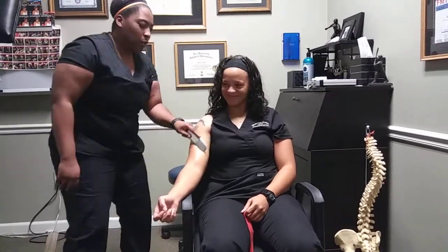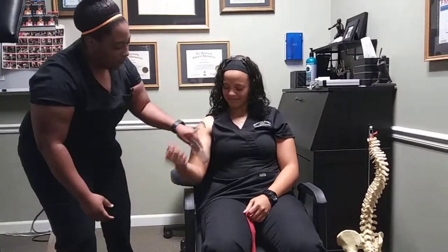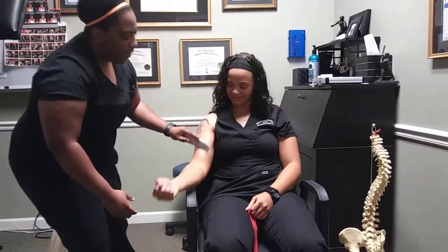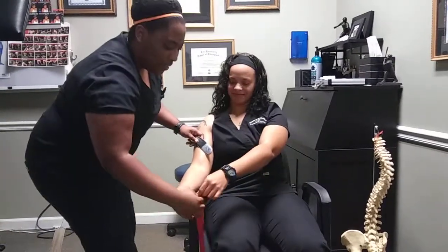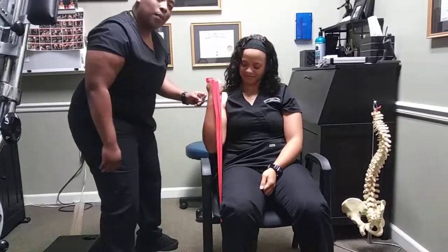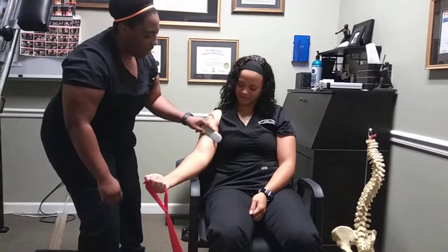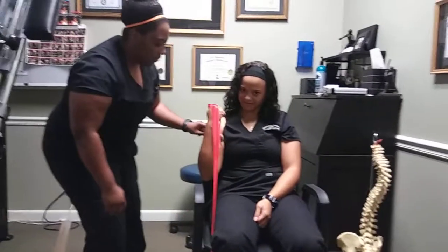I'm going to have the patient go through active range of motion. Then we're going to take the patient through some resistant motion using a resistance band wrapped around her fingers, doing that same motion — keeping the tool at a 30 to 60 degree angle for 30 seconds.